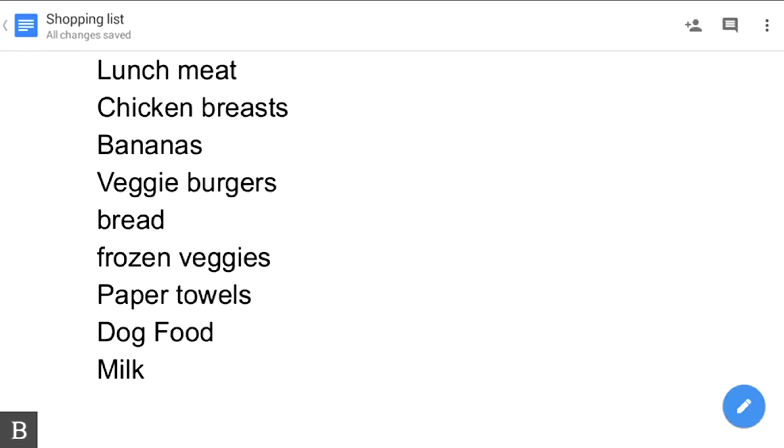I've updated this Google Doc in the cloud. On my wife's phone or computer or whatever else, she'll be able to see that we now need to buy dog food and milk the next time we go to the store.